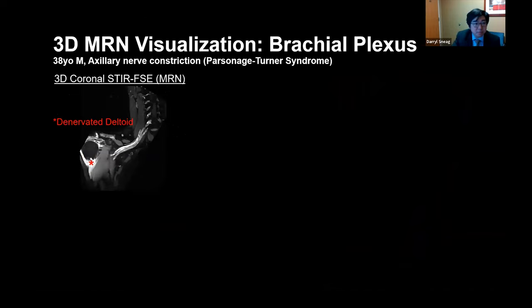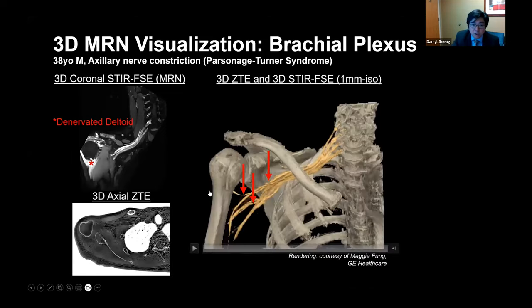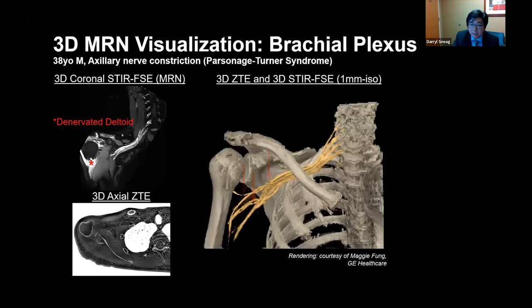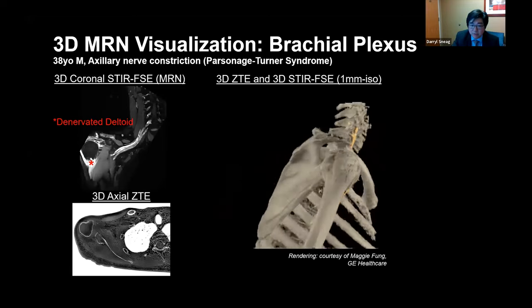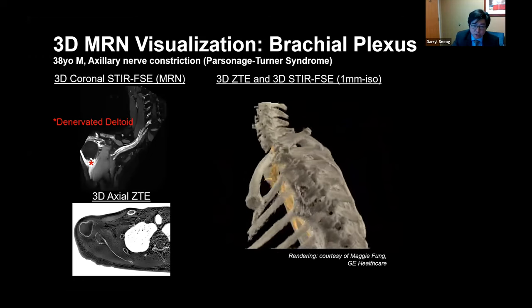A brachial plexus example: a 38-year-old male with axillary nerve constriction from Parsonage-Turner syndrome, with a denervated deltoid. We acquire 3D MRN to see the constrictions, then acquire a 3D ZTE for bone, render both together, and observe the constrictions in the axillary nerve — courtesy of our colleagues at GE Healthcare. The surgeon can see both bony landmarks and nerve constriction locations simultaneously.